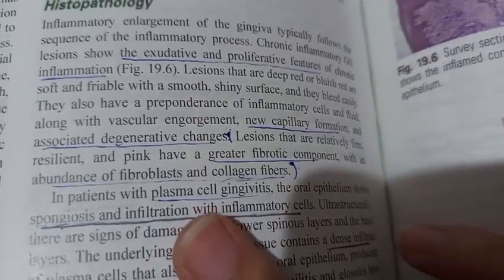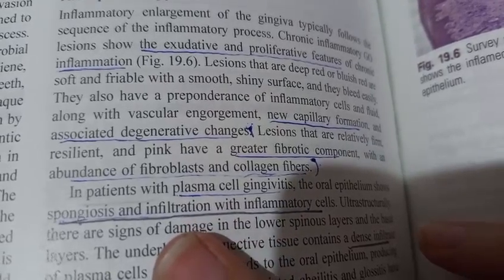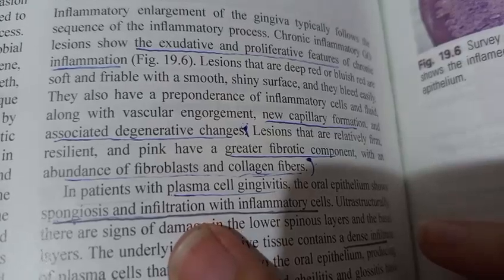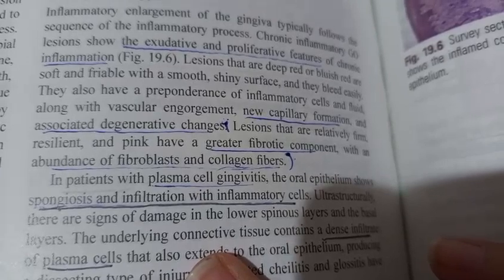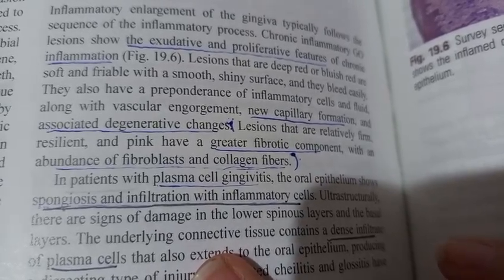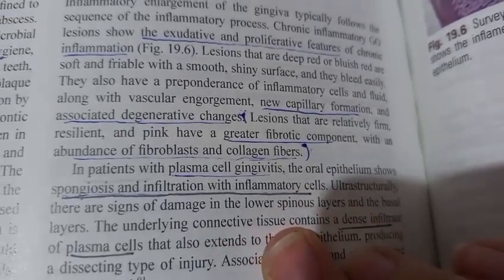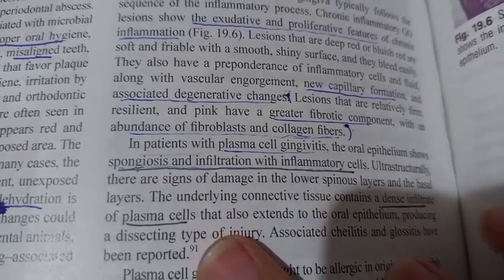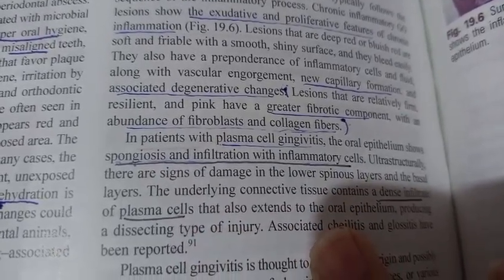Now in plasma cell gingivitis, the oral epithelium will show spongiosis, edema of the cells, and infiltration with inflammatory cells. You will see signs of damage in the lower spinous layer and basal layers. The connective tissue will have a dense infiltrate of plasma cells, that will extend to the oral epithelium.